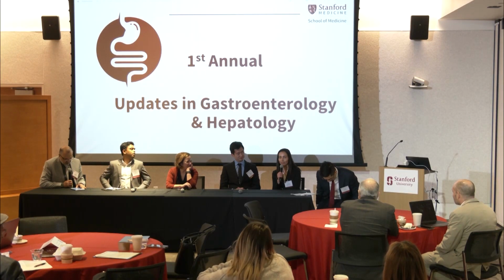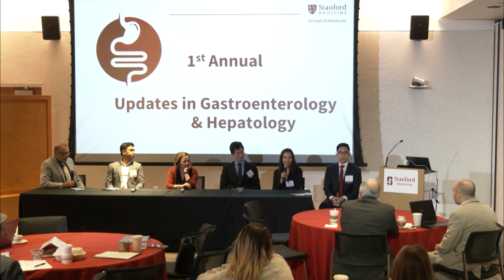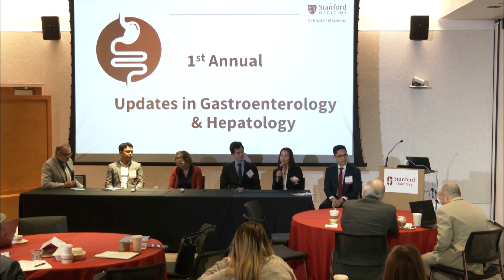First question: is there still a role for pneumatic dilation for treating achalasia and EG junction outlet obstruction? Yes, I do think there's still a role, though it is far less common. We had another conference a month and a half ago, and Dr. John Clark convinced me that when you truly look at the evidence, there's definitely still a role. There are patients who don't want that intervention, or maybe don't need a full POEM or myotomy, and we do see decent response rates with pneumatic dilation as well. So yes, there's definitely still a role for that.